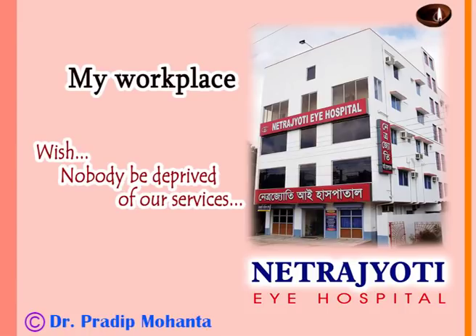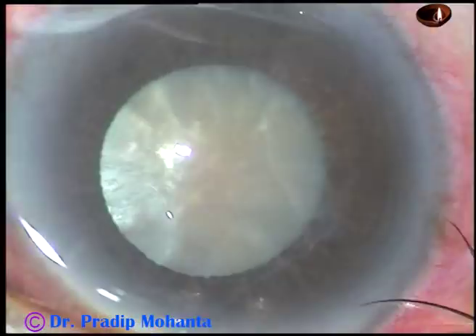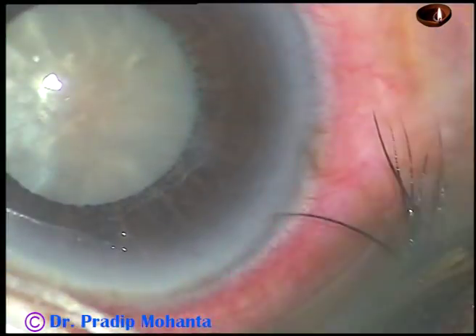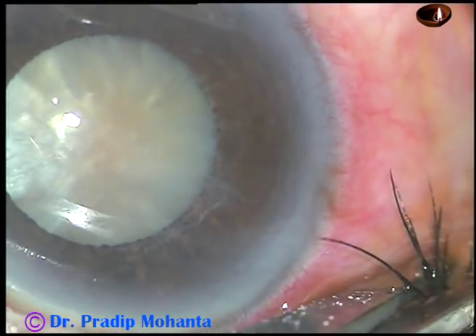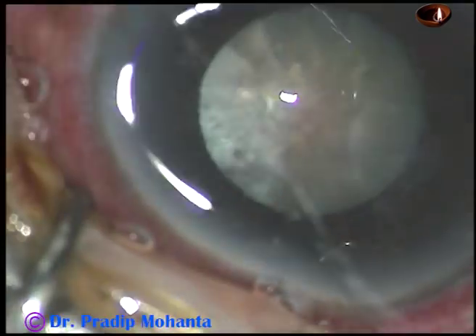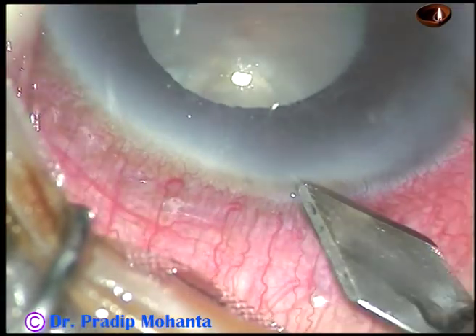Friends, welcome to my workplace at Ranaghat, West Bengal, India. This is a mature white cataract with pseudo exfoliation with small pupil, so a lot of challenges in this case. If the eyelashes are not properly covered, cut the lashes flush at the lid margin, and thoroughly irrigate the ocular surface with balanced salt solution.